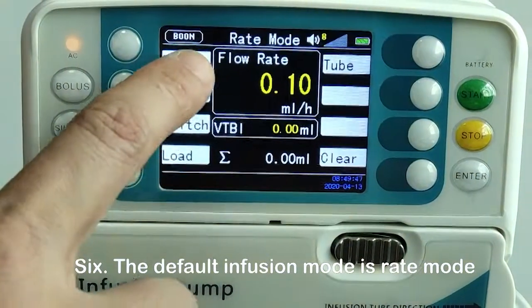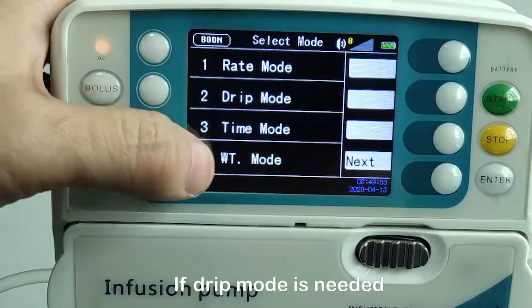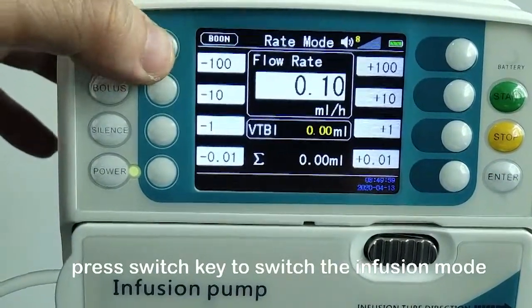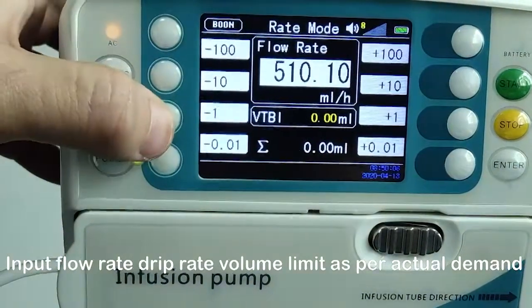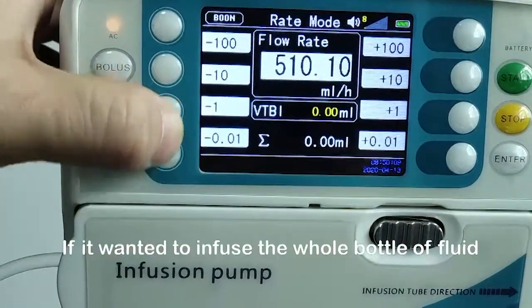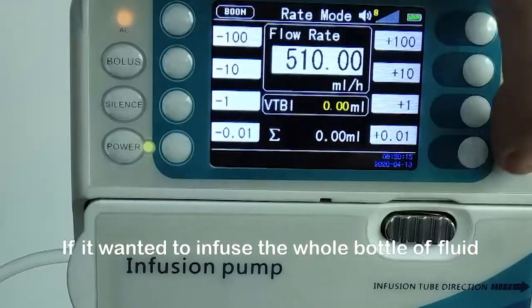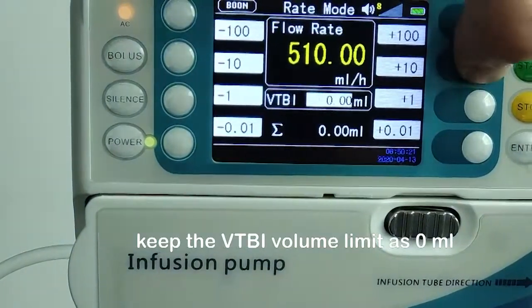Step 6: The default infusion mode is rate mode. If drip mode is needed, press the switch key to change the infusion mode. Input the flow rate, drip rate, and volume limit as per actual demand. If you want to infuse the whole bottle of fluid, keep the VTBI volume limit set to 0 milliliters.